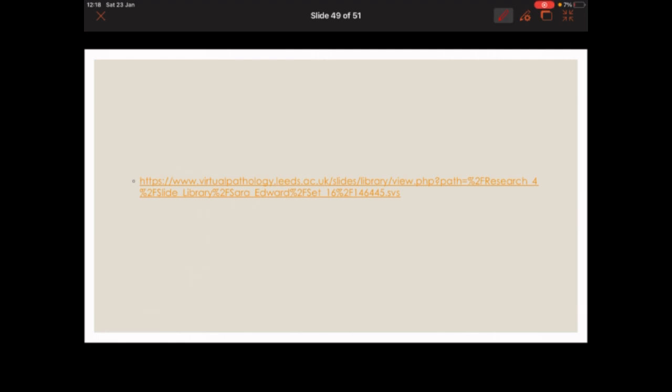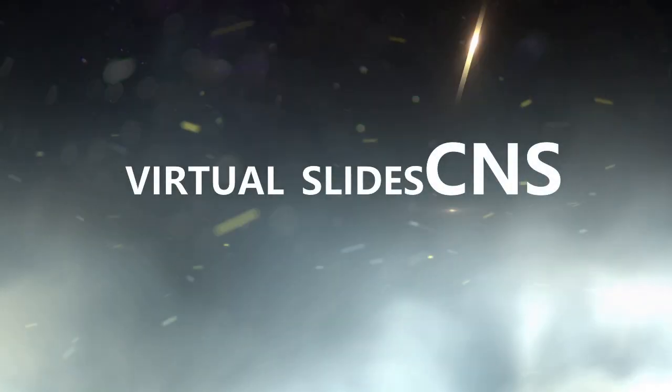Later, I think I will share the virtual slides of all the tumors that we discussed here.